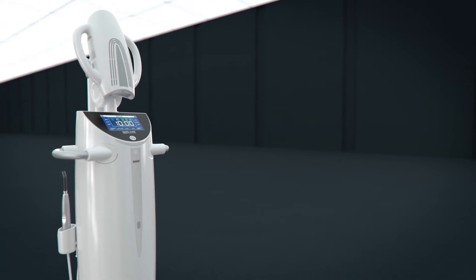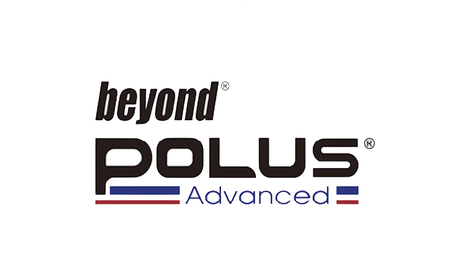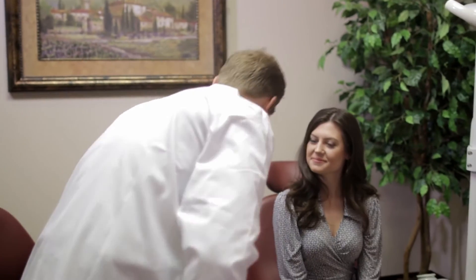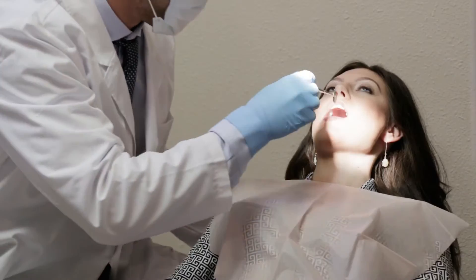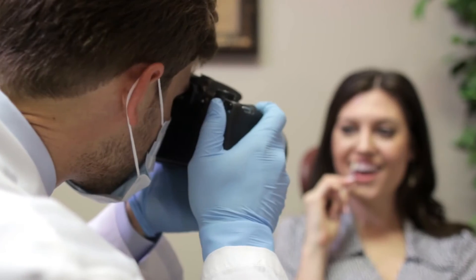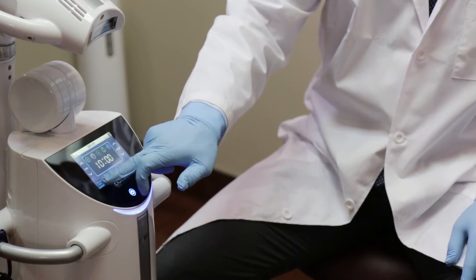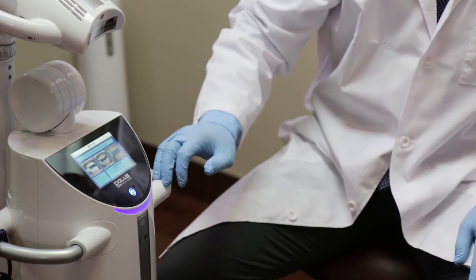This is the Beyond Polus Advanced. Perform a pre-treatment oral exam and consult with the patient on his or her desired whitening results to determine the best treatment plan. Determine the pre-treatment color of the patient's teeth and take a photo to document the shade before starting treatment. Turn on the Beyond Polus Advanced system and program the desired treatment time as discussed with the patient.